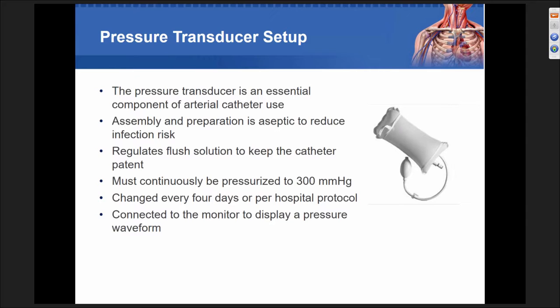And if your bag runs low or the pressure in the bag is reduced, then you get a dampened or sort of an occlusion type formation within the catheter body, and we're going to talk about that in great length when we get to the troubleshooting section.